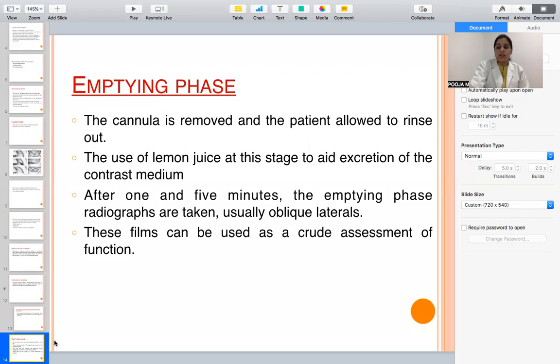After filling, after injection of the contrast medium is done, the next thing you will be doing is taking a radiograph again. It can be a PA view, a lateral oblique view or an occlusal view. Based on the involvement of the gland, you take a radiograph such as an OPG and lateral oblique view, which is helpful for any pathology or ductal obliteration or obstruction of the parotid gland. Whereas if the submandibular duct is obstructed, then the occlusal view is helpful. And the PA view is also helpful for both ductal obstructions.